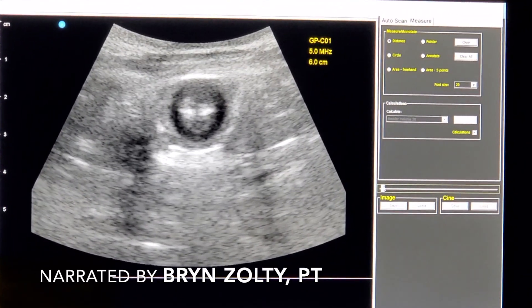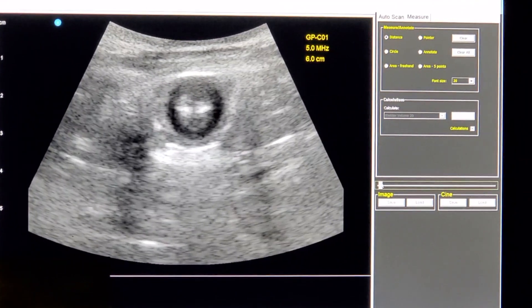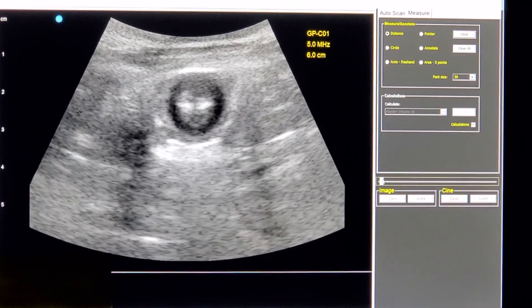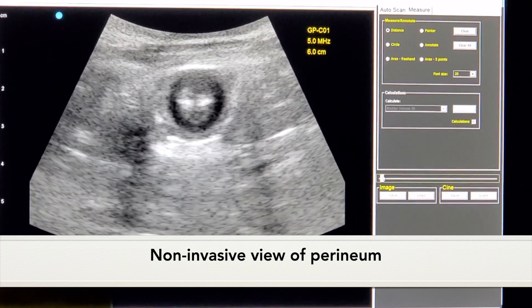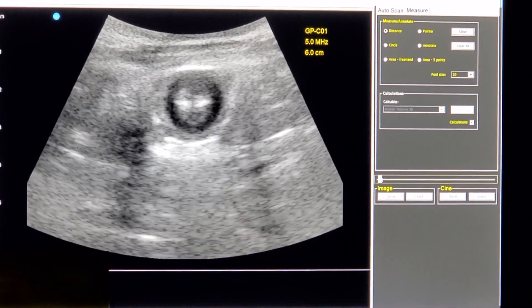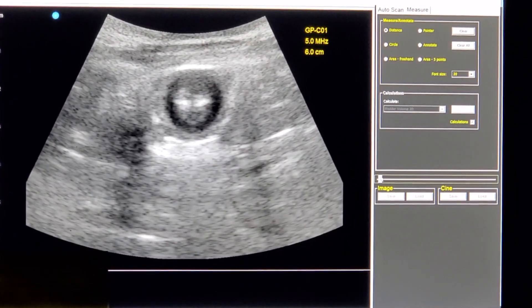This is a quick view of the ultrasound we have at Connect Physical Therapy. This quick video is to show you how we use the ultrasound as a non-invasive tool — we can actually put the ultrasound head on the outside of the body, on the skin, on the perineum, to help the patient view what they're doing when they're attempting to bear down.